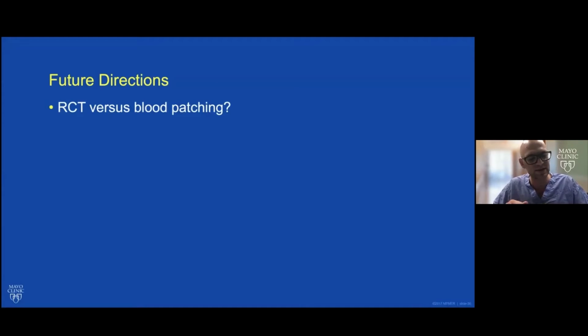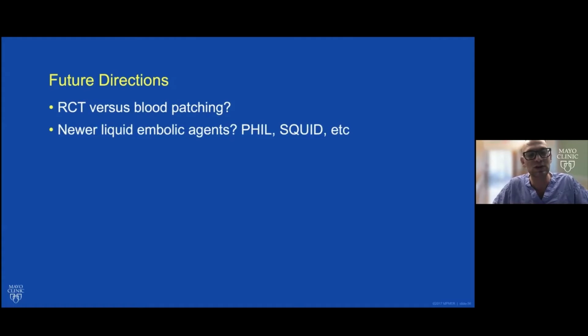I think it's time to consider RCTs versus blood patching and surgery. And just like in other areas of minimally invasive therapy, everything's going to have a role, and endovascular might have a role for some cases where blood patching may struggle, or some fistulas where blood patching may struggle, and the same against surgery. There are newer liquid embolic agents coming out that use the same copolymer that Onyx uses, but they're less radiopaque, so they're not going to create as many artifactual issues.